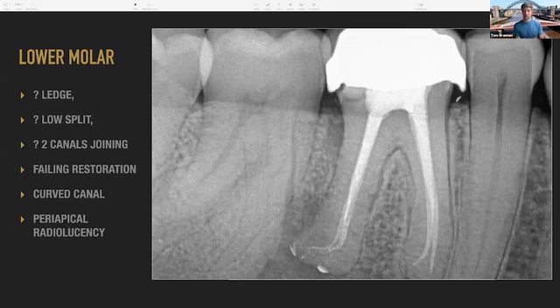And so now he's going to go back and see his referring dentist quite soon afterwards to get the restoration replaced, because there probably is a little bit of caries distally, and that'll need managed as well. But I'm still happy that the tooth is restorable. We've checked what we can.